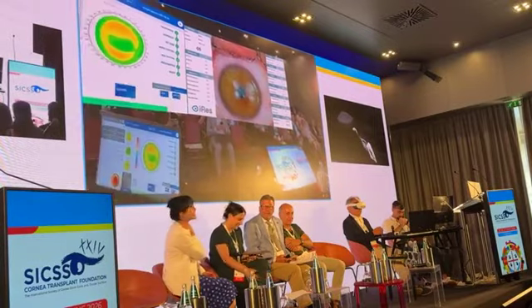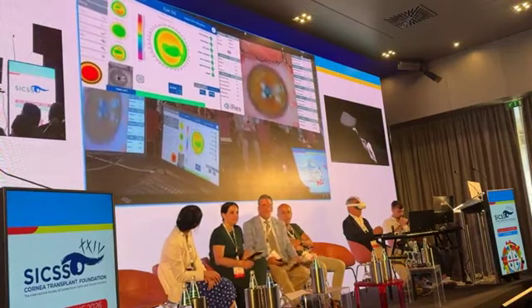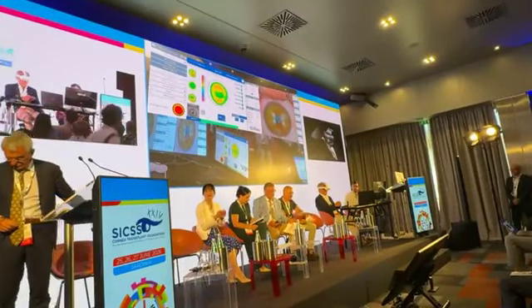So this is basically to allow the surgeon, wherever he is, to control by remote surgery, to allow wherever the patient lives, the same chance of success, no matter where basically the treatment is performed. Thank you.